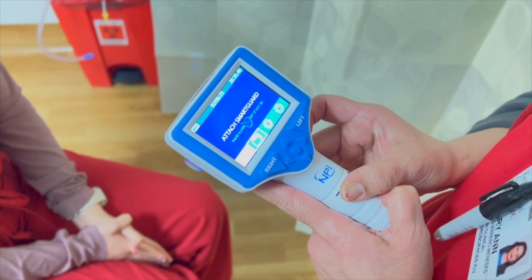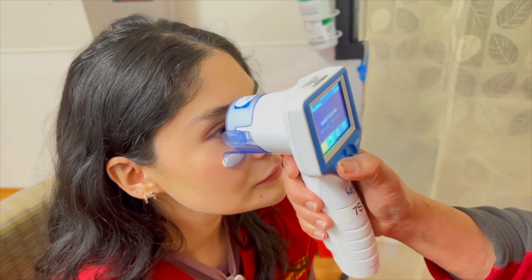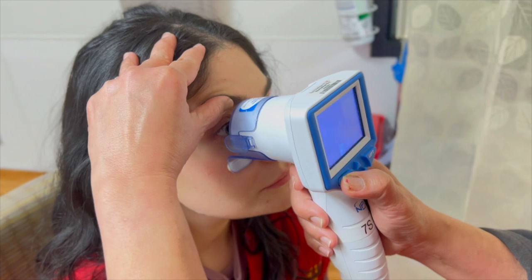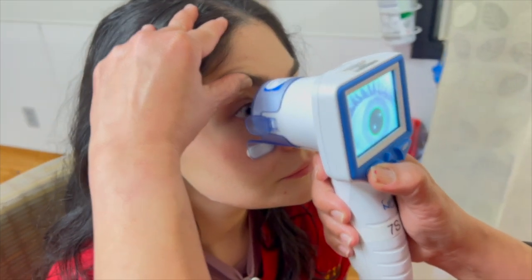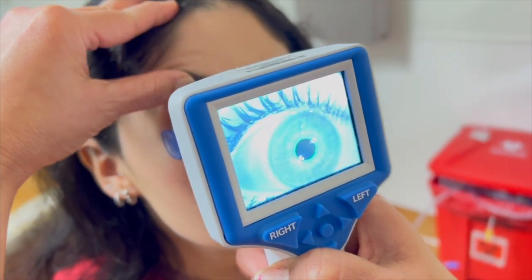Position the Pupilometer in front of the right or left eye with the foam pad of the smart guard resting at the top of the patient's cheekbone below the eye. Maintain the eyelid in a fully open position and hold the Pupilometer at a right angle to the patient's axis of vision, minimizing any tilting of the device.